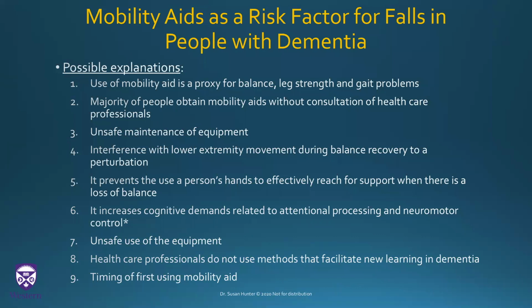So we need to be aware that this is a potentially brain-intensive activity for people, and that distractions in the environment, be it ambient noise or conversations, can actually end up deteriorating the benefits that people have from using their aids. Seventh reason is unsafe use of equipment.